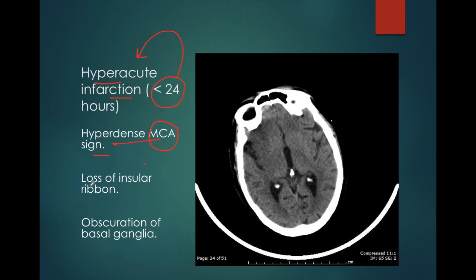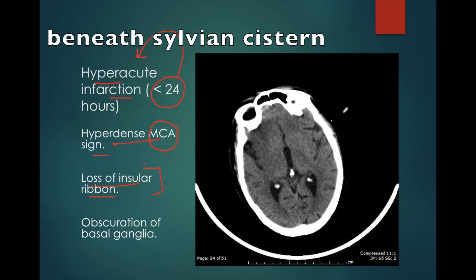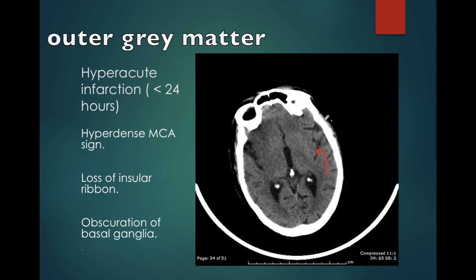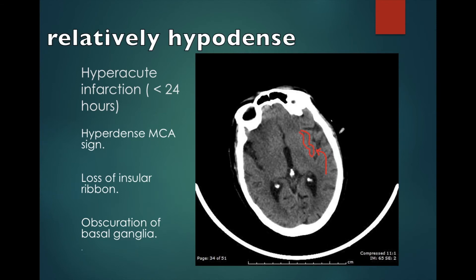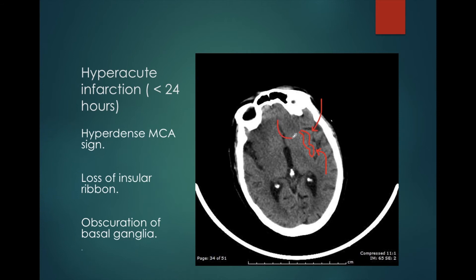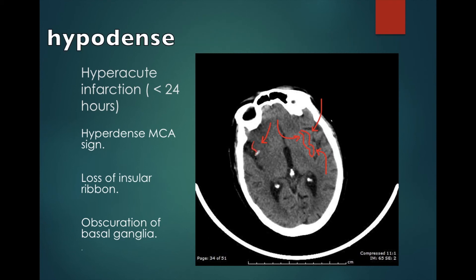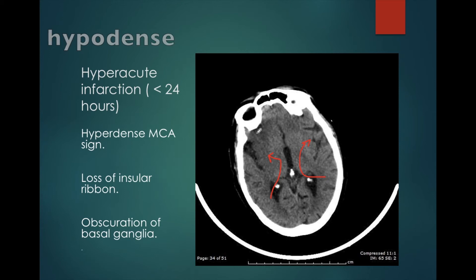There is also another sign known as loss of the insular ribbon. The insular cortex is the area of the brain that lies beneath the sylvian fissure. We can see that the insular cortex consists of an outer core of gray matter which appears hyperdense and an inner core of white matter which appears relatively hypodense. So this part is the gray matter of the insular cortex and this is the sub-insular white matter. But on the right side, this insular differentiation of the cortex is lost, and the insular cortex appears hypodense. This is known as the insular ribbon sign.